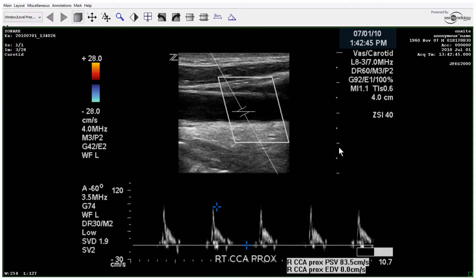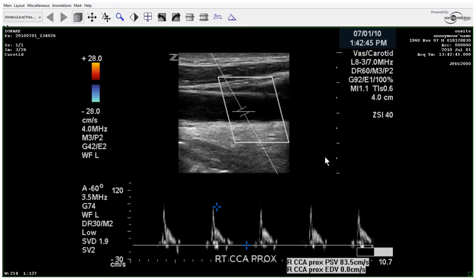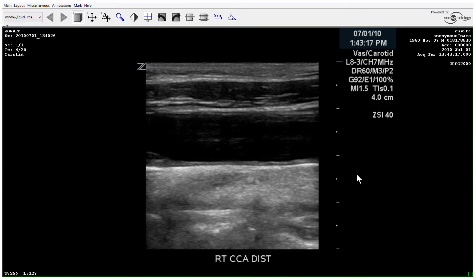Here they take a spectral Doppler waveform at the proximal common carotid and you'll notice the abnormal waveform. So immediately you should be thinking there is a problem upstream. If you have a sharp upstroke without any diastolic flow, this is likely due to a distal obstruction of some sort.